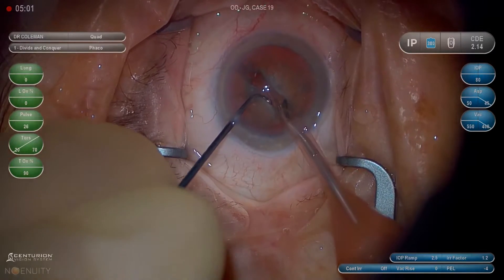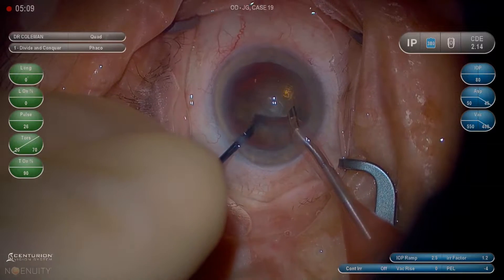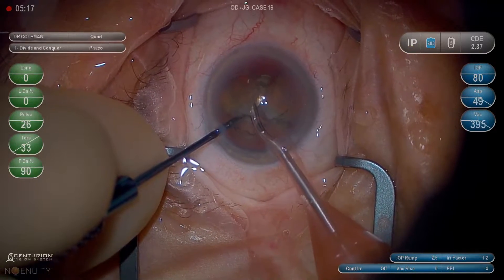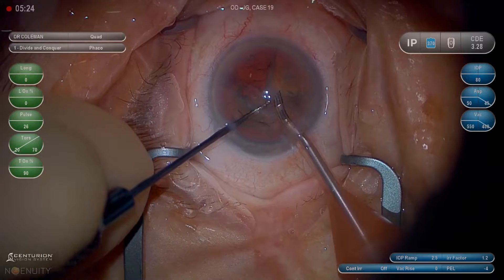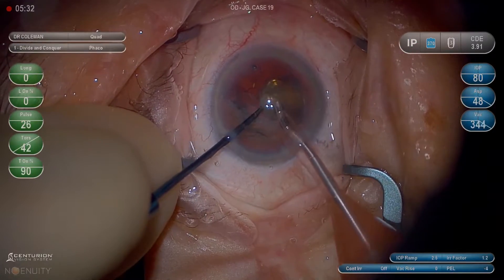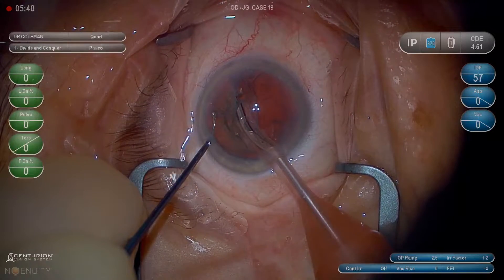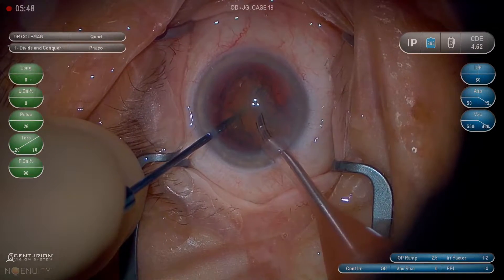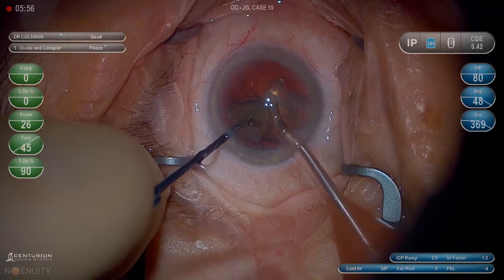The key to the crack is getting the chopper position deep down into the groove. The chopper should be slightly more posterior than the phaco tip. I'm going to lift the hemi-nucleus up and make sure that I crack off a complete quarter. We don't want to take an eighth or a sixth because the other piece will be too big and it will be difficult to raise into the anterior chamber. We'll bring the other quarter up — the hemi-nucleus still present in the bag is holding the posterior capsule back, making our risk of touching the posterior capsule low at this point. We want to crack as close to a perfect quarter as possible. I think that's the most efficient way to get the nucleus out.